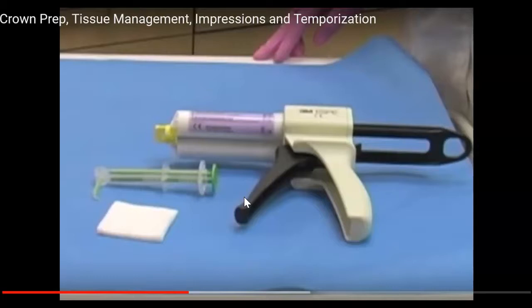As you're going to see here in a minute, it's going to be dispensed into some sort of a syringe. The dentist is going to place that around the tooth, making sure to have that material kind of flow, and it's a light bodied material, and it's going to be a lot thinner, so it's going to allow it to spread over the anatomy of that tooth much easier than if they were to use a heavy body, which is why they use it.